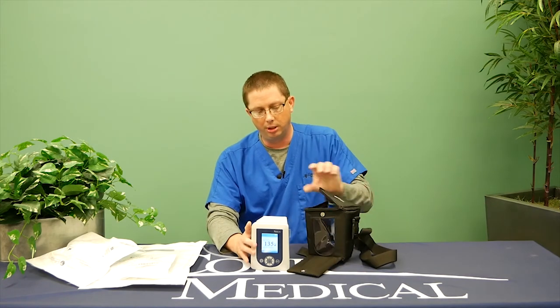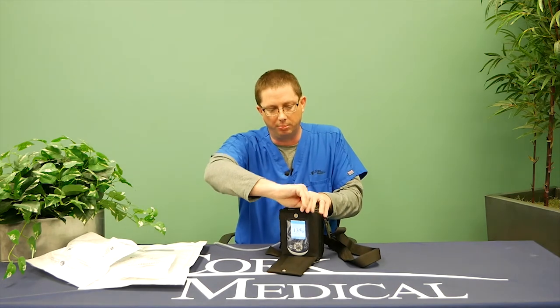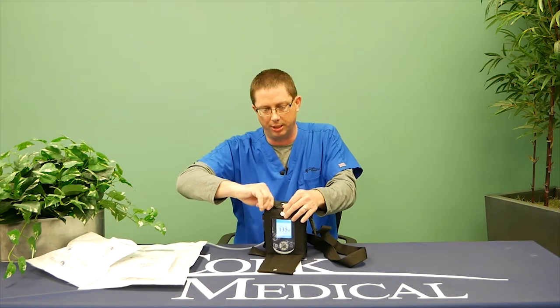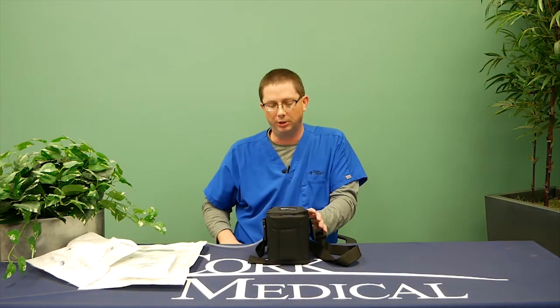When you're done replacing the canister, please place it back in the black bag. Place the pump in there, zip up the top, and close the front pouch. Now your therapy is resumed back to where it was previously.